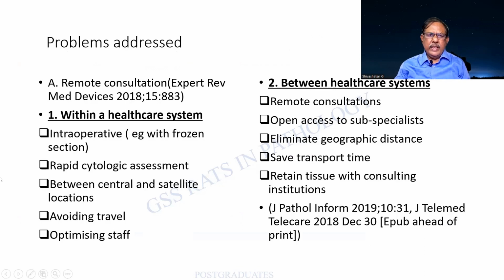Now, what are the problems? Within the healthcare system itself, you find intraoperative, that can be a frozen section. Rapid cytological assessment can be made. Between the center and the satellite locations, it can be used. Avoiding travel and optimizing staff.